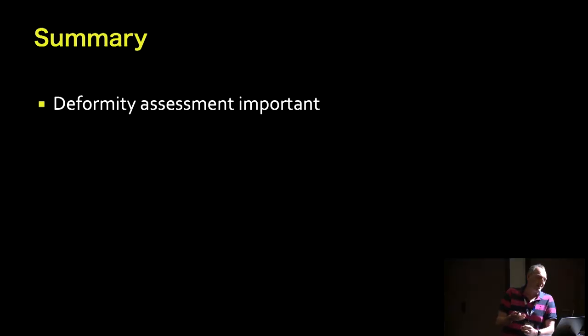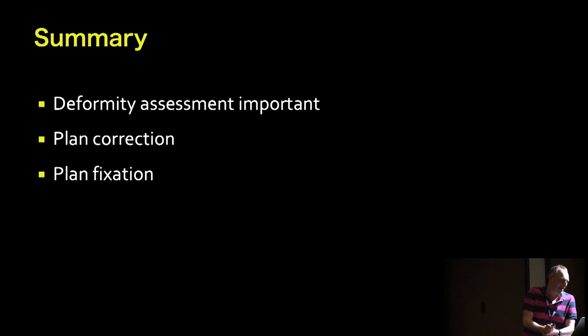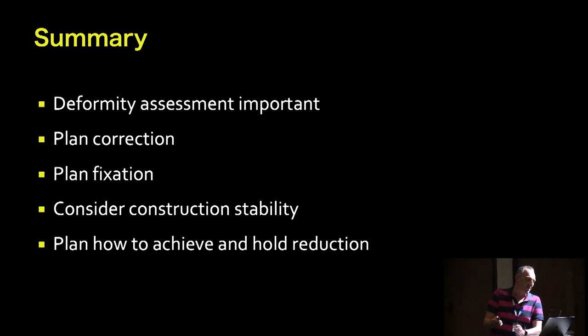So just to summarize those points, these are very generic messages to take away. Deformity assessment is absolutely critical in any of these cases, particularly when you're using internal fixation. Plan your correction, but also plan your fixation. Consider the stability of whatever construct you're going to use, and consider that the demands placed upon it are likely to be greater than, or different to, those in fracture management. Plan how you're going to achieve and hold the reduction.